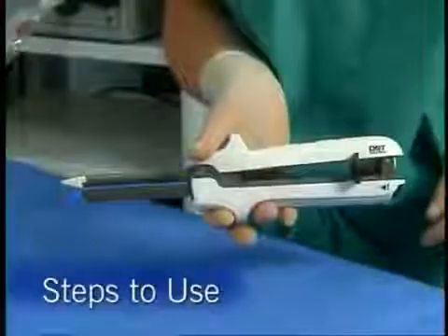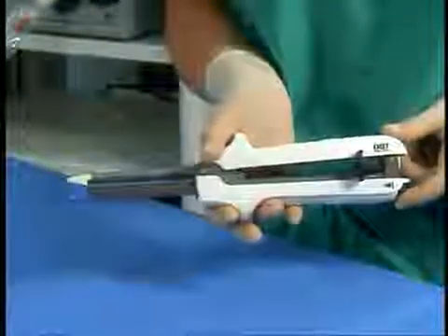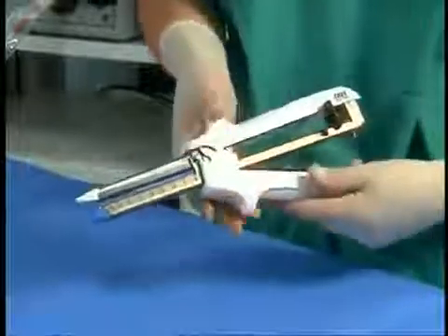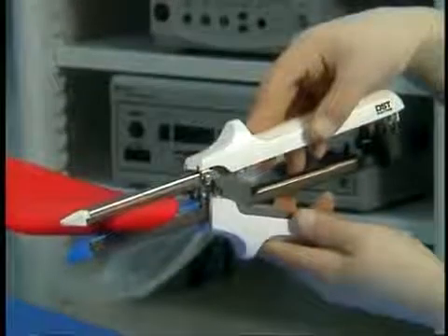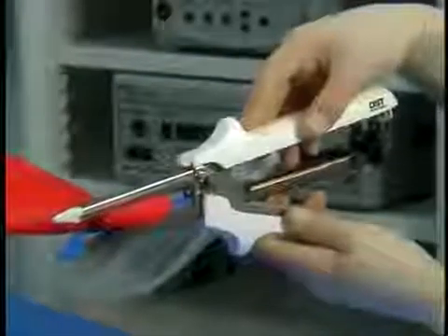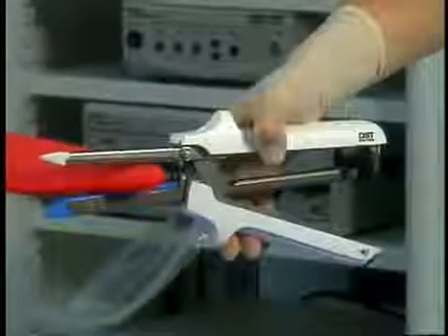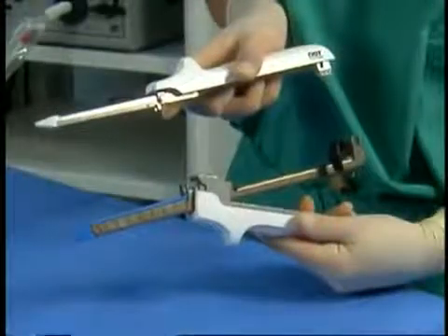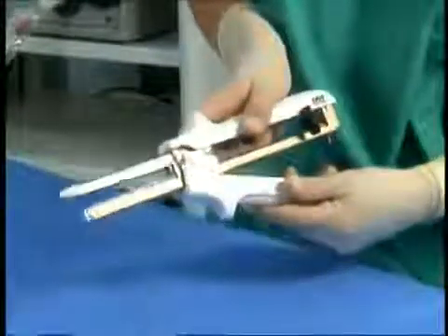Steps to use: Open the instrument and separate the forks by pressing the black release button at the rear of the instrument. Apply the instrument across tissue with the lock lever in its fully open position. The instrument forks can be applied in a scissor-like fashion or separately.